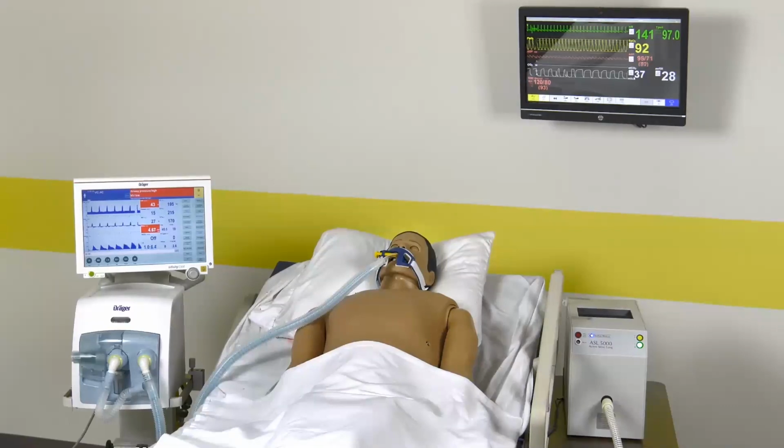So that means that the ASL 5000 is producing both inhaled and exhaled tidal volumes for our patient. So if we had the SimMan not intubated and we were simulating a spontaneously breathing patient in LEAP, and you placed your hand over the mannequin's mouth, you would actually feel that exhaled tidal volume.